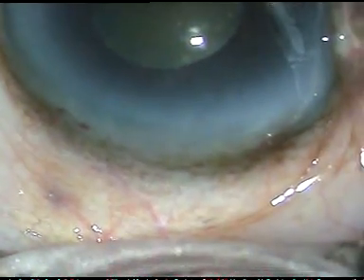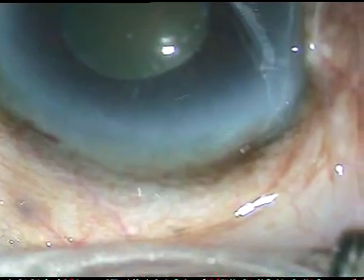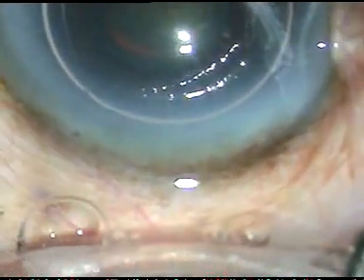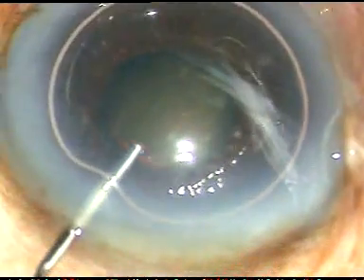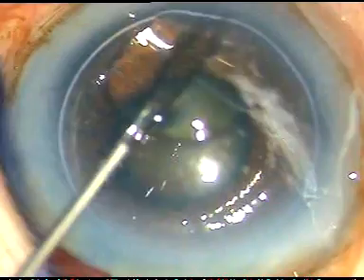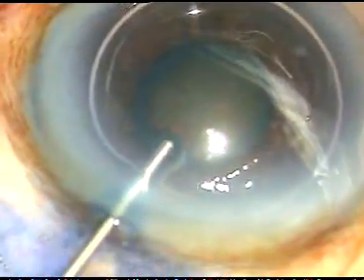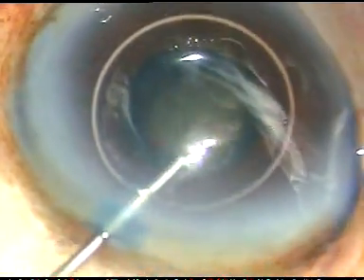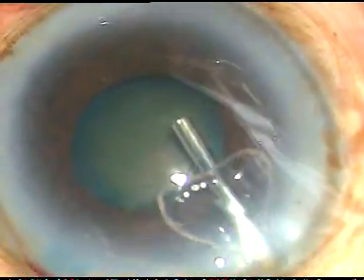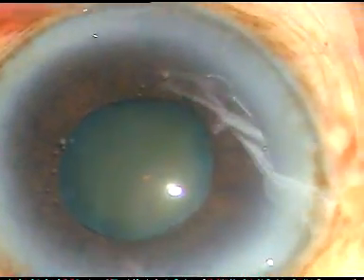Now I am going to stain the anterior capsule underneath this air bubble. Here is the Trypan Blue dye, 0.06%. And here is adrenaline. I want to see if the pupil dilates a bit with the help of intracameral application of adrenaline, but in this case adrenaline had no effect.